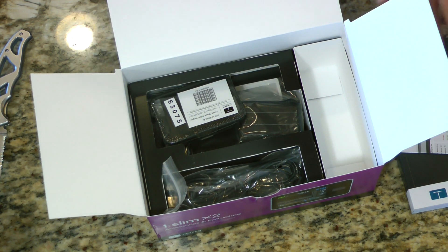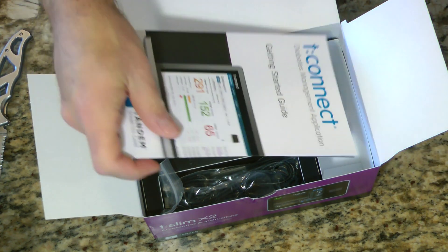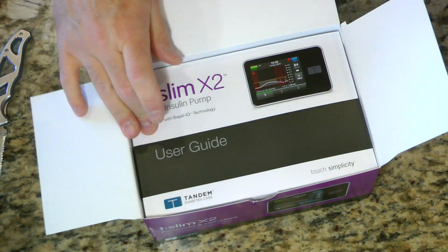I guess we're ready to go. There you go, all unboxed. And I'm excited — I'm very excited to put it to work.